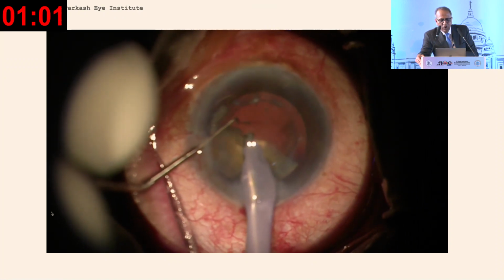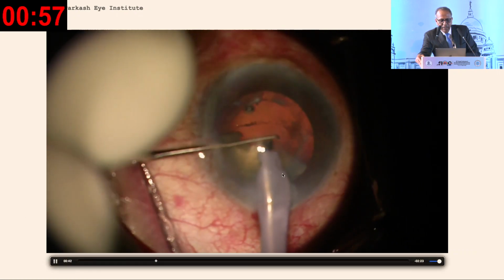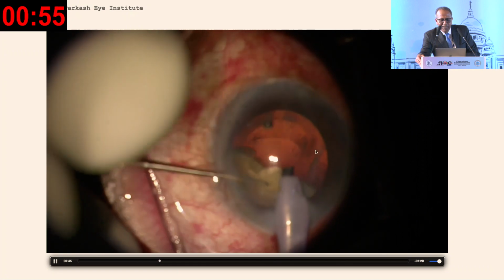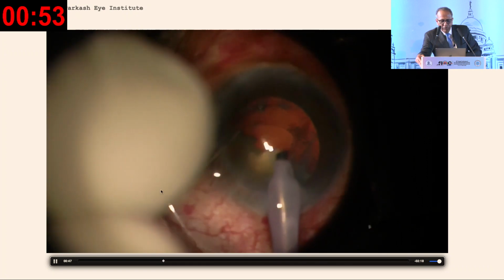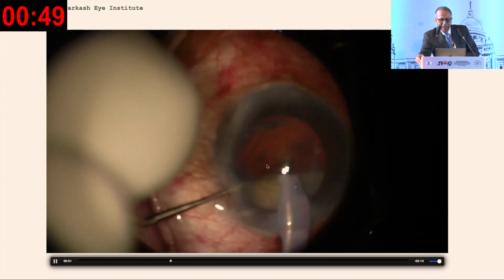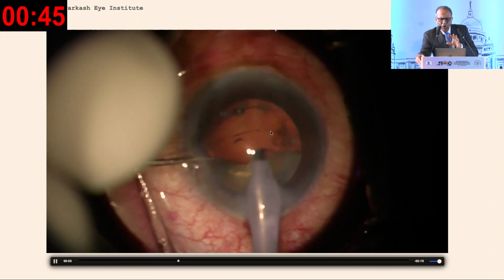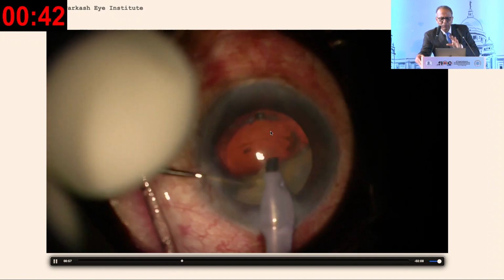Now again I'm caught on the wrong footing. This is a subincisional one with posterior capsule right across. You will find at this stage that there is some dimpling in the cornea. This shows that I have used low fluidics and I'm not pushing it.